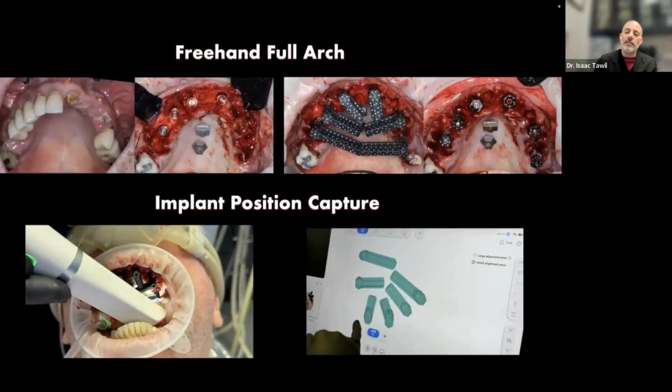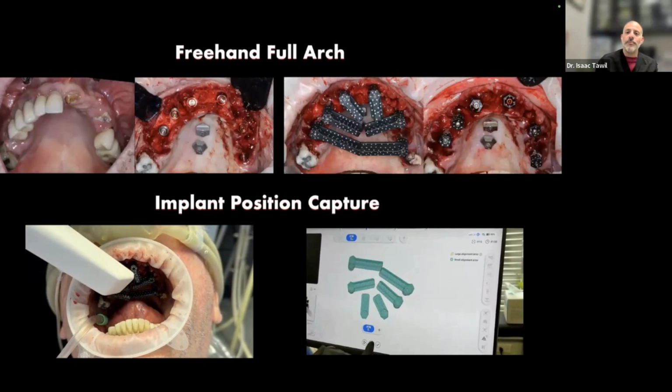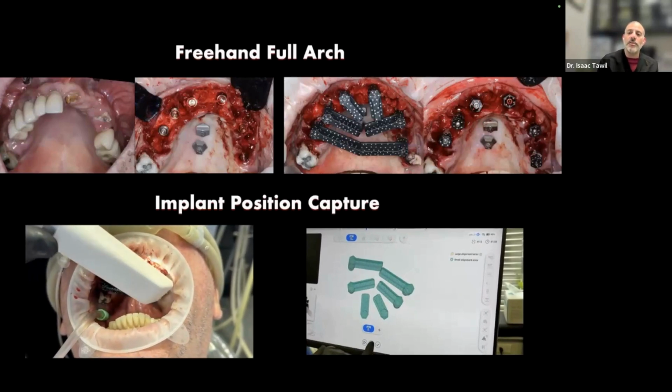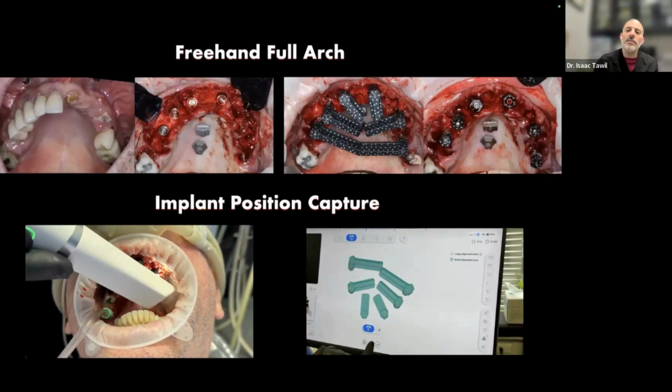Basically, what we've done is we extracted the teeth, we placed the implants, we did our capture of fiducial marker, we put our photogrammetry flags in. You see on the bottom right, we're capturing that photogrammetry. But now the main thing is that circled fiducial marker at the top is matching to the post over there. And we're only missing right now those photogrammetric matching. So the only link that is missing right now is for that third picture on the top to be linked to the fourth picture. And that's what those CAP scan bodies will do.